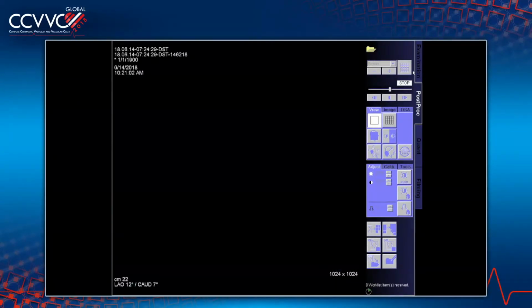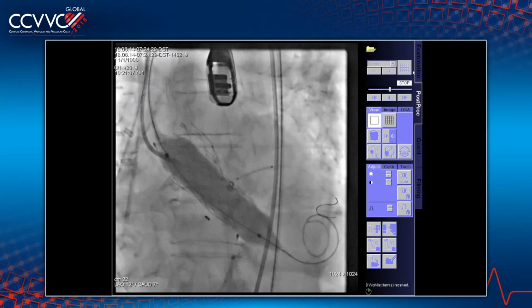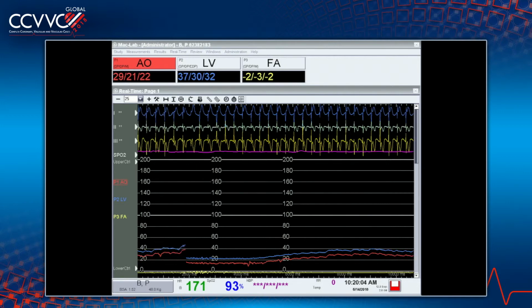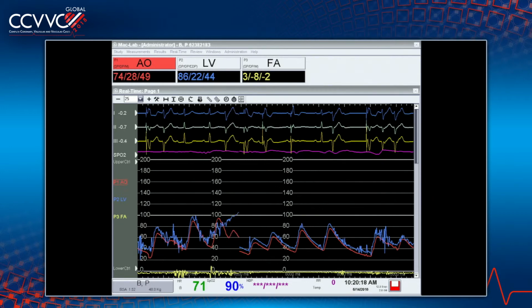Why don't you use a True Flow balloon here? Yes. Why can't they show the hemodynamics? They can show, just wait till it's on. We're still pacing. Very important, you don't pull and stop pacing too much. Good, now we have stopped. Okay, let's check another angio, the left main. A lot of people are concerned that you can move the valve, but the balloon was... So the key is not to stop it prematurely.